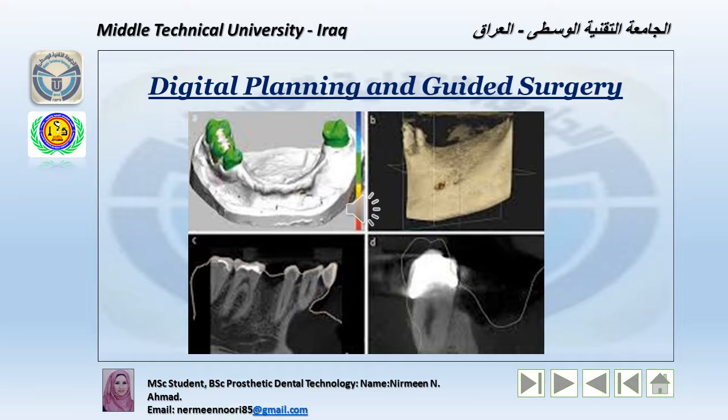The emergence of computerized tomography has revolutionized image exams by obtaining a much clearer image of the anatomical structures and the three-dimensional reconstruction, associating the concept of stereolithography and CAD-CAM technology.